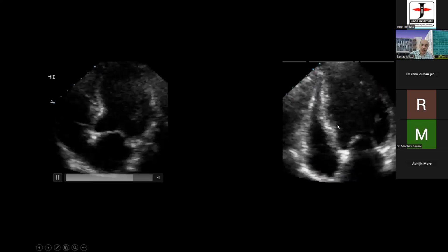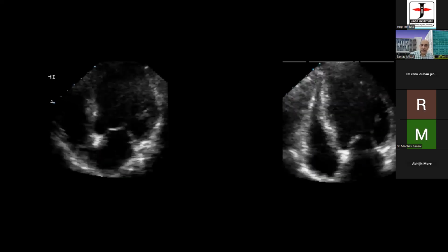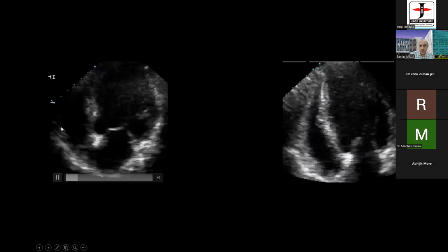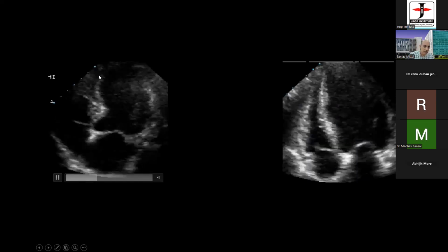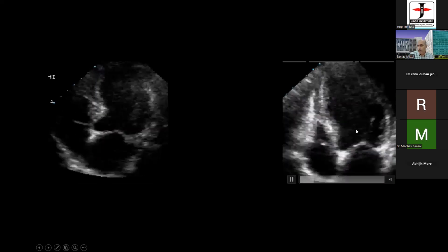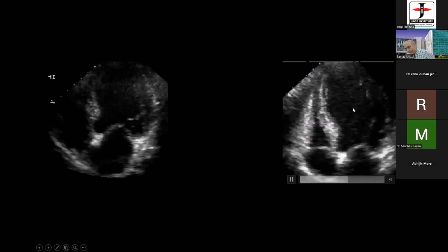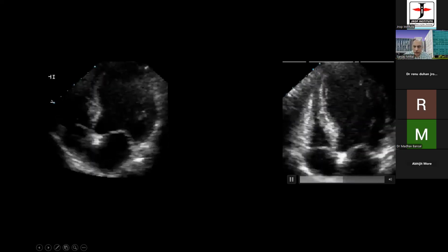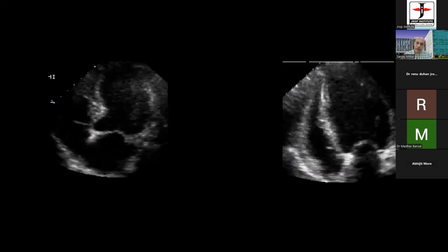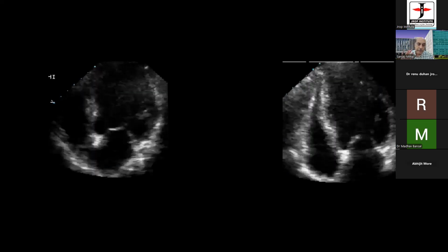So this is how the ventricular assessment is different. But you would be more than surprised to understand that both these views, one where we called 45% with a minimal amount of wall motion abnormality, and one we called a maximally injured ventricle, 20 to 25 with a maximal amount of wall motion abnormality, almost completely LV gone, they are both from the same patient, just 5 or 10 seconds apart.